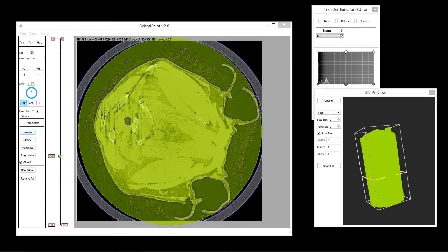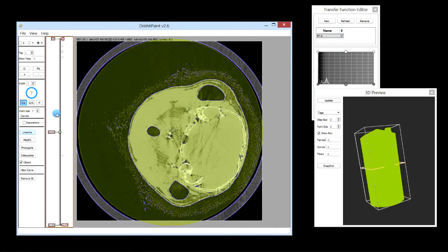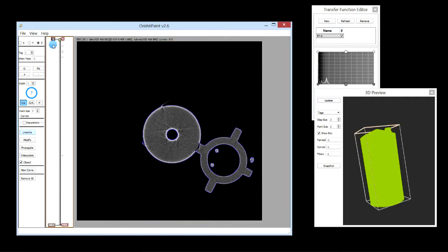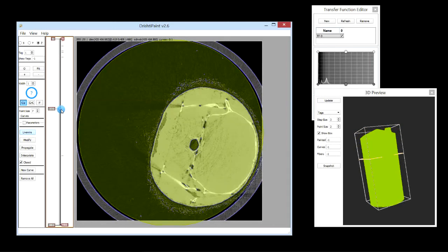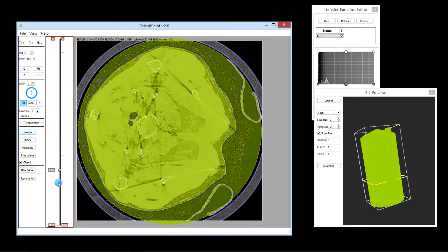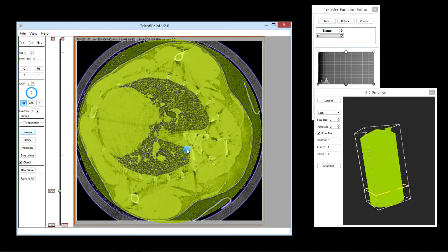In one of the previous videos, we basically removed the outer cylinder from this mouse dataset and extracted the mouse from this tomogram. We used ellipses to select the region where the mouse was. In this video, what we will do is try to extract the lungs.